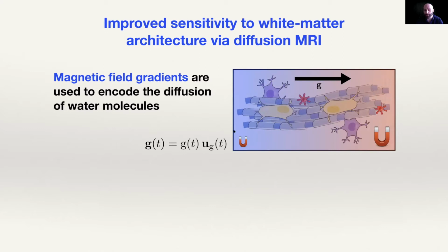If you use this and you use magnetic field gradients, the effect will be to create a slope in the strength of the local magnetic field. And then when you use this resonance in the MRI acquisition, you're going to have different local magnetic fields, so different precession rates. Obviously, for one excitation in your MRI image, you're going to find signal decay because some spins are not seeing the same magnetic fields as others. It's just that in that case, you know exactly what slope you put in there, because it's the gradient. So you can assess in which direction this signal decay is occurring more than in other directions.